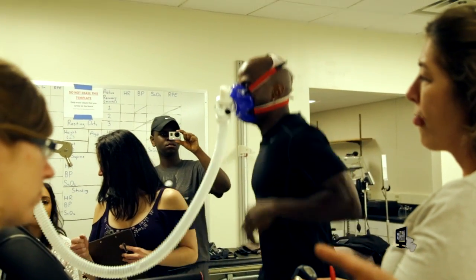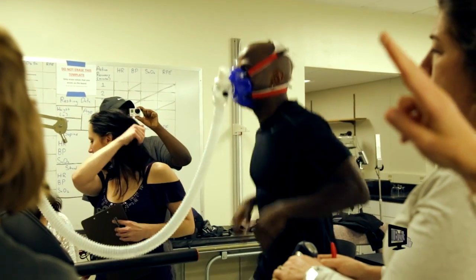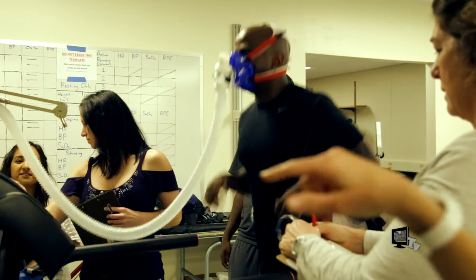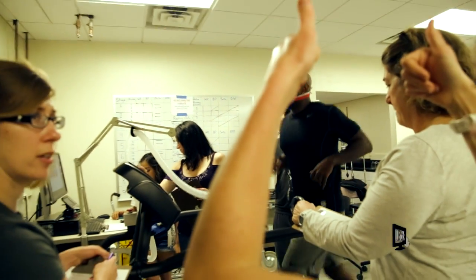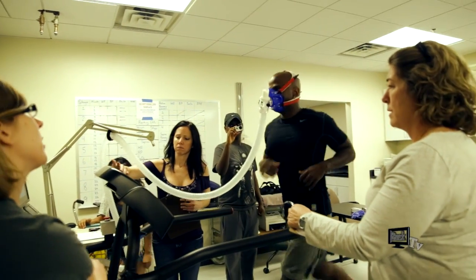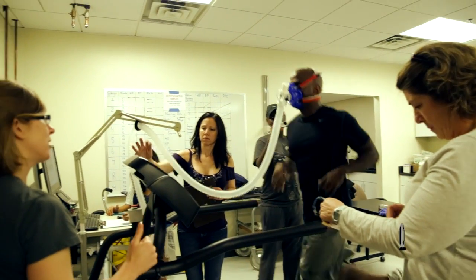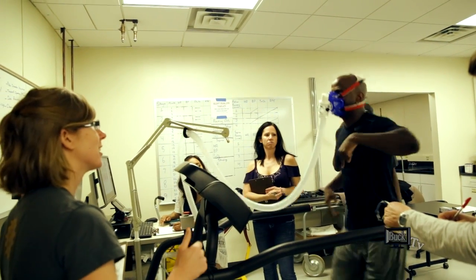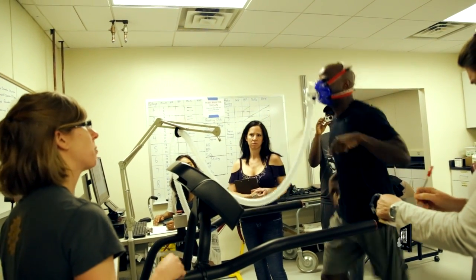Will you let us know when there's a minute down, 2 minutes down? Oh, we're 10 seconds away from the 30 minutes. Okay, so we need to get the RPE soon, right? Yeah. So 10 seconds, we're going up? All right, give us an RPE. So go ahead. RPE 6, 7, 8, 9. Yeah, 7. RPE 6.